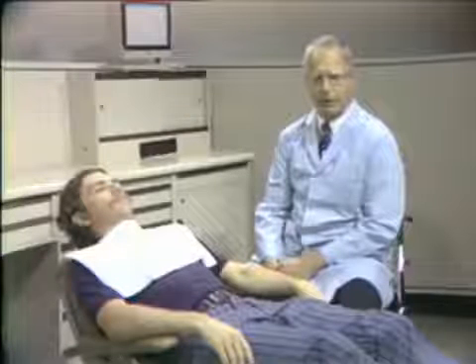You have read about and seen additional material on local anesthetic injection techniques. We're going to put it in motion for you by demonstrating not only on the skull various injections, but on a patient as well. You have previously seen or will see a tape on preparation of syringes, both the carpule and the luer lock type of syringe, so we won't repeat that today.